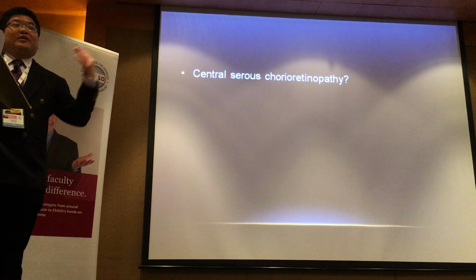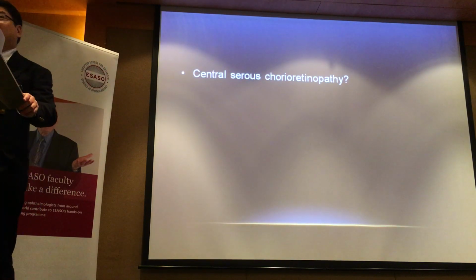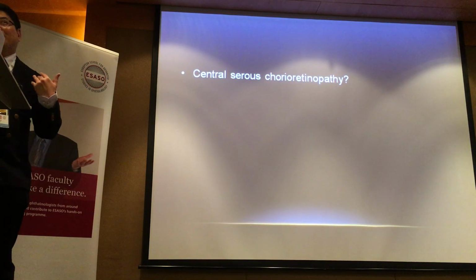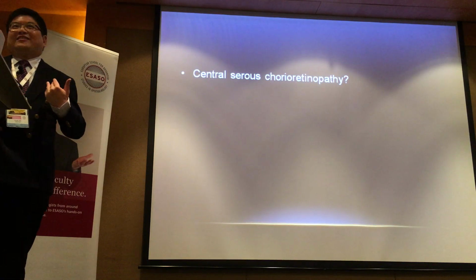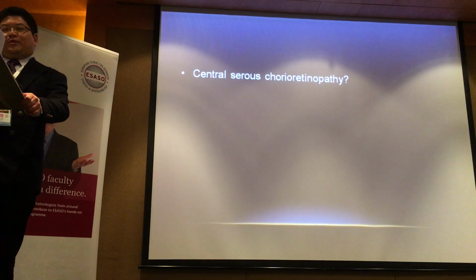But when a colleague sends to you, this was a consultant from another subspecialty, and says, is this AMD? The pressure goes on you, right? Because you don't want to be wrong. And they sent to you for a reason. So what did I do?